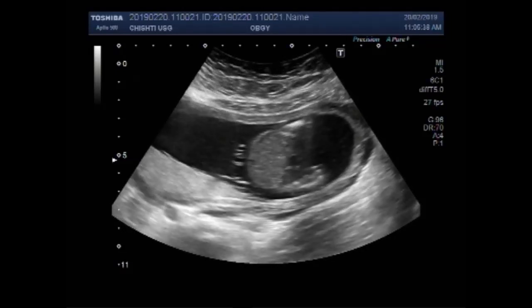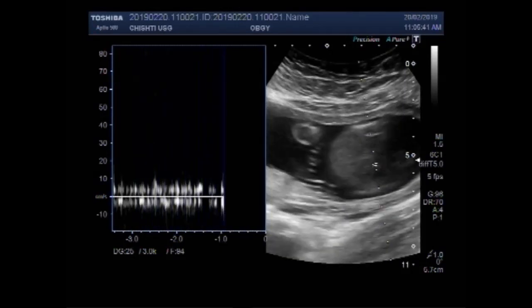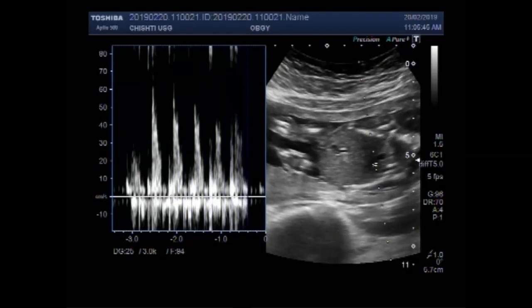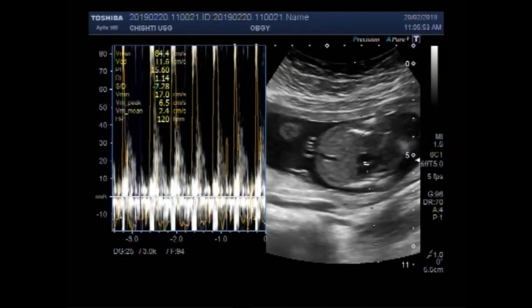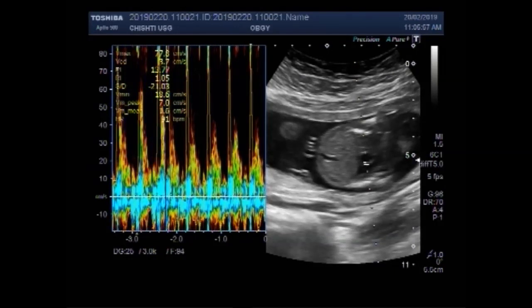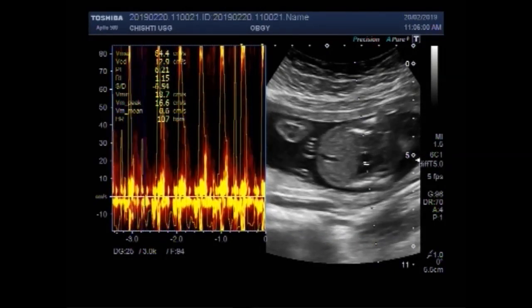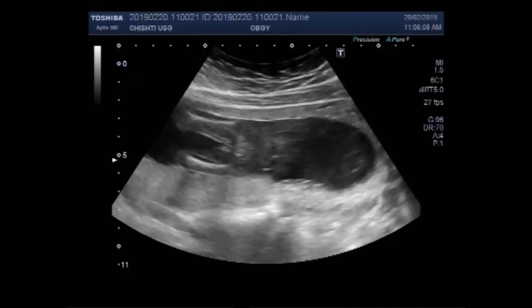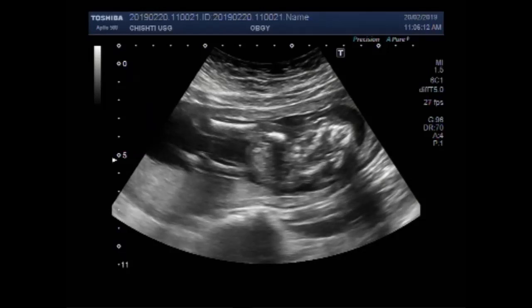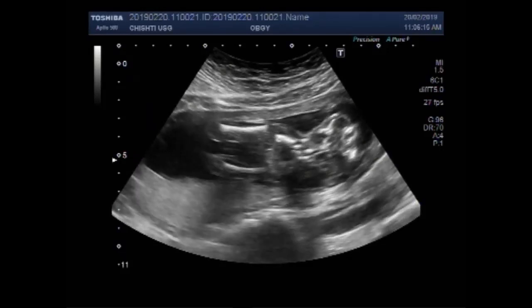You can see the fetal cardiac activity is visible and audible. You can see the fetus is visible. Now these are both the femurs. You can see both the femurs.